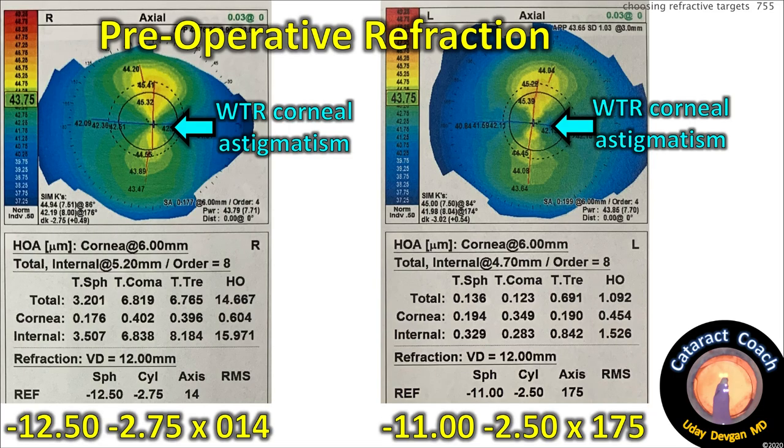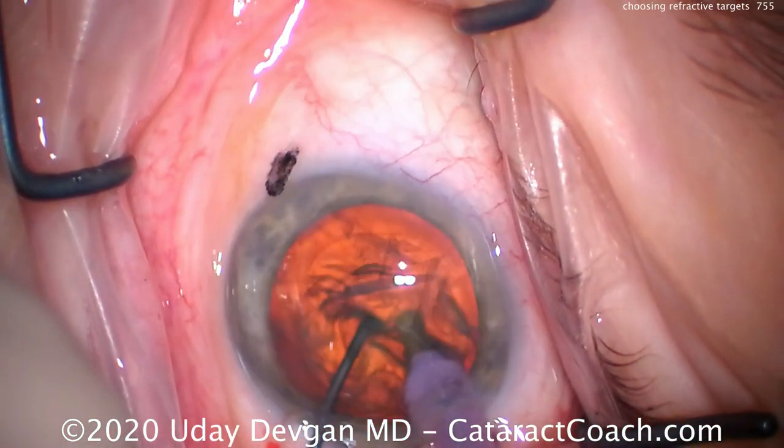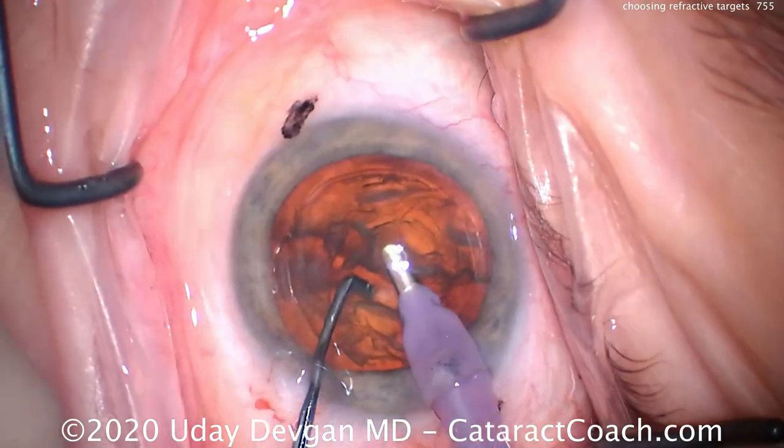Here's the patient: minus 12, minus 11 of myopia, two and a half of astigmatism — let's do this cataract surgery. Here's my technique: phaco-chop in the capsule bag, split the nucleus so we can remove it. Let's speed up the video.